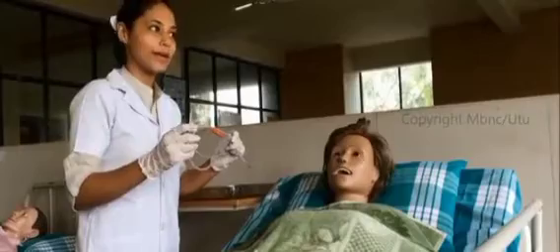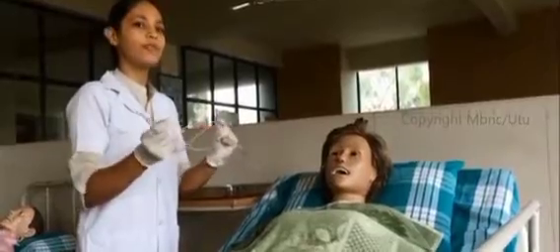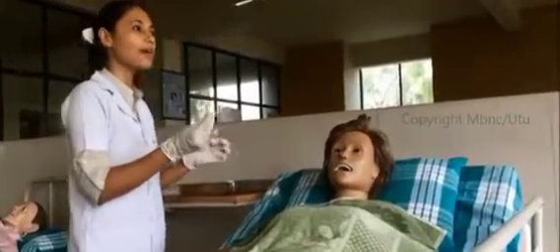Now normally the esophagus length, the anatomical structure, is 25 centimeter. So approximately, when we are measuring for an adult, it will be between 50 to 60 centimeters. So how do we have to measure? From the tip of the nose to the earlobe, we have to keep it like this way. We have to do the measurement.